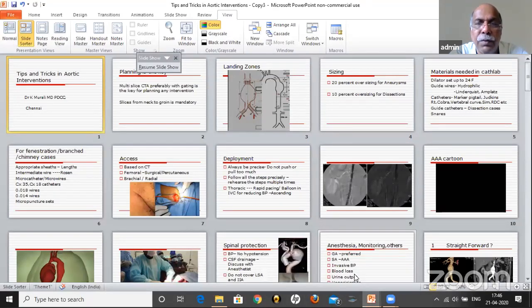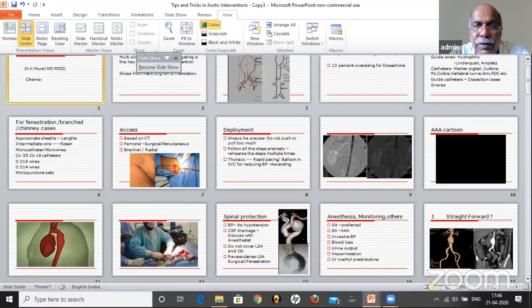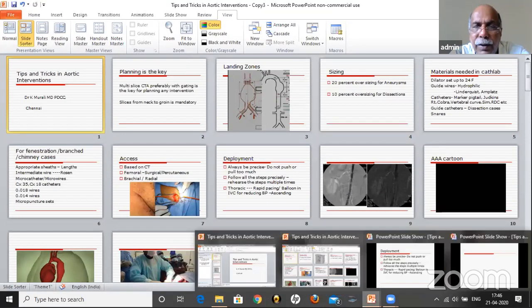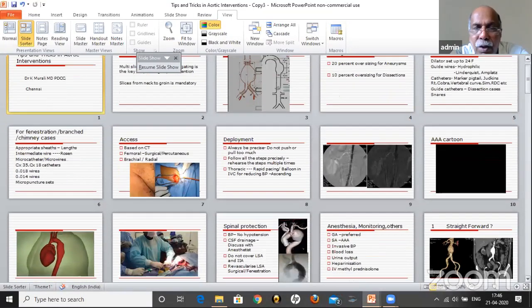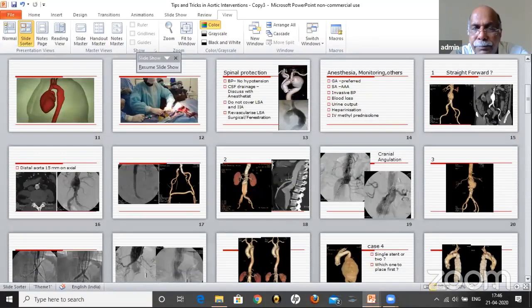In my small experience with Dr. Michael Dake, Stanford, USA, we follow the rule that in case of usage of two stents, deploy the one with the smaller diameter first, and then the bigger diameter for a better seal. Additionally, if two stents of the same diameter are used, deploy the proximal one first and then the distal. I think that's what we do always.